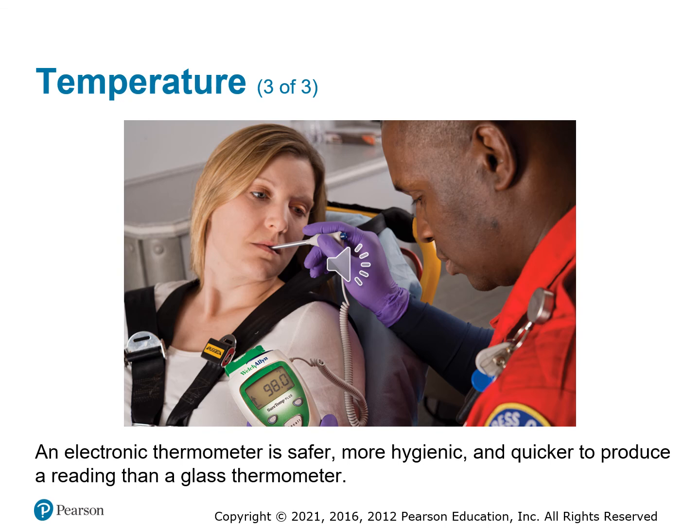At some point in the assessment process, you do want to make sure to get a thermometer out and measure what that temp is. It used to be that we didn't measure temps all that often in an ambulance, but anymore they've determined that it really does clue you in a lot on things from COVID to sepsis that we'll learn about as we go through the book. And it has become a pretty good tool in the assessment process.